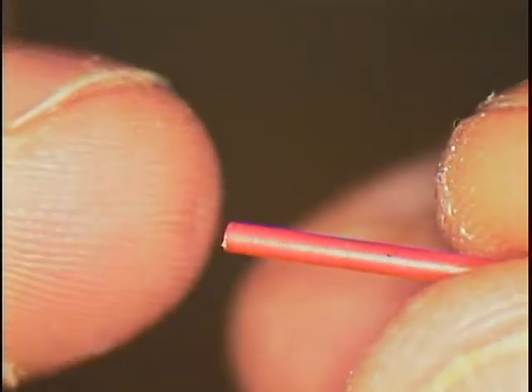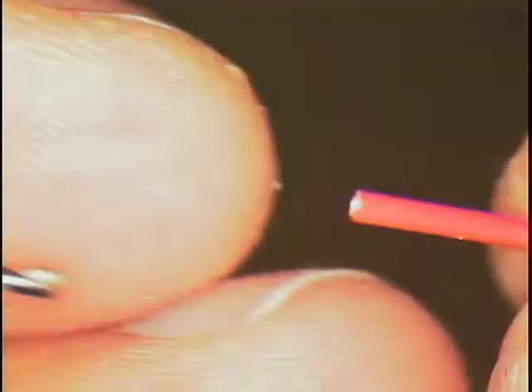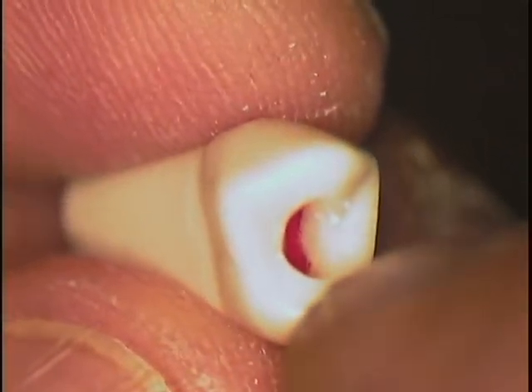And what we normally put in the mouth is a metal post. This is plastic for practice. All right? And that has to go all the way down on the lingual side of the tooth. So I haven't reamed out, I haven't cleansed and shaped the lingual canal, but for this demonstration I'm going to go right to drilling post room so you know how to do that. And then we're going to turn you loose. Okay.